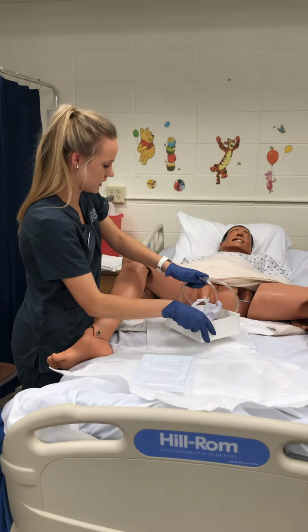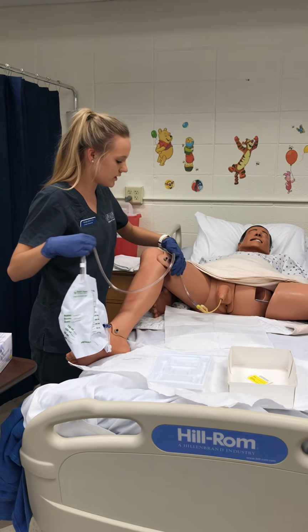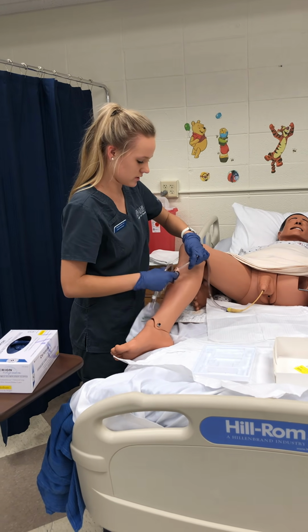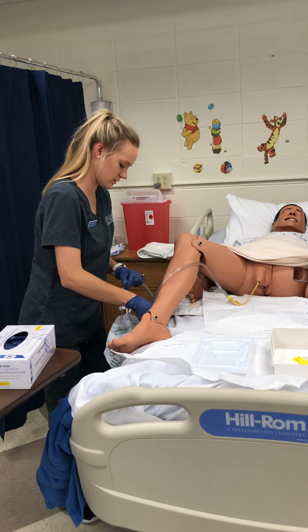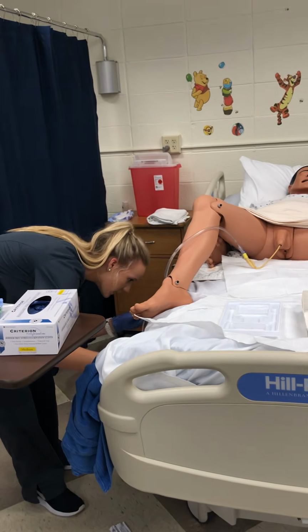Okay, I want to make sure that I take my catheter back. I want to secure it to the leg where there's slack so it doesn't pull. I also want to make sure there's no loops of any sort. I want to clip it to the bed sheet here, and then I'm going to take the bag and put it on an immovable part of the bed underneath.